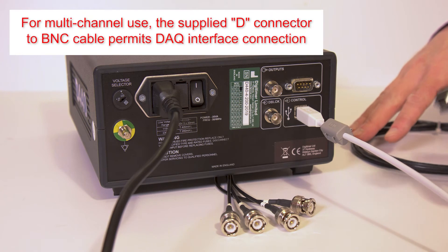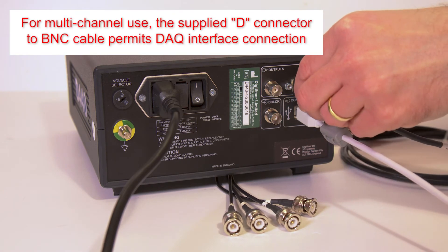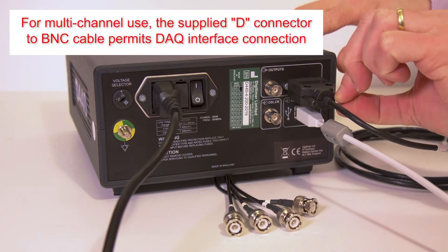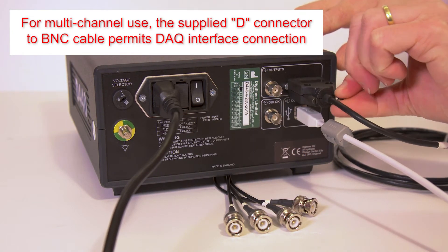If two or more channels are being used, we provide two or four channel output leads that terminate with multiple BNC plugs for connection to your chosen data acquisition system.